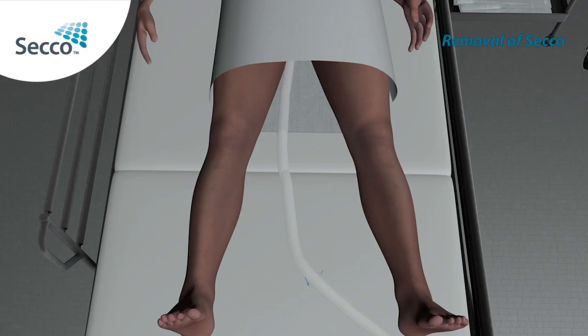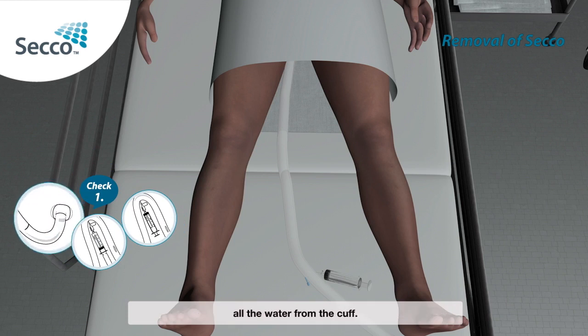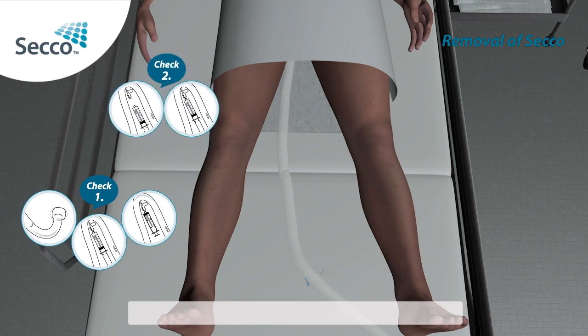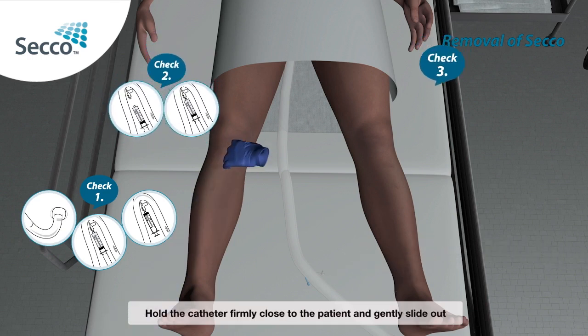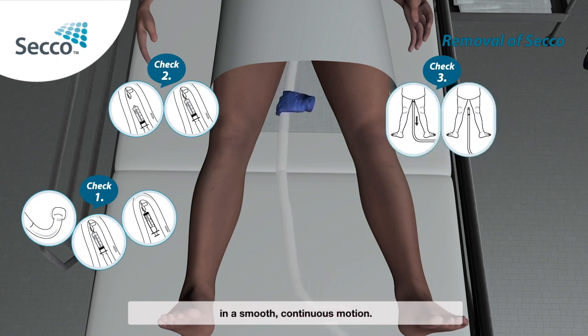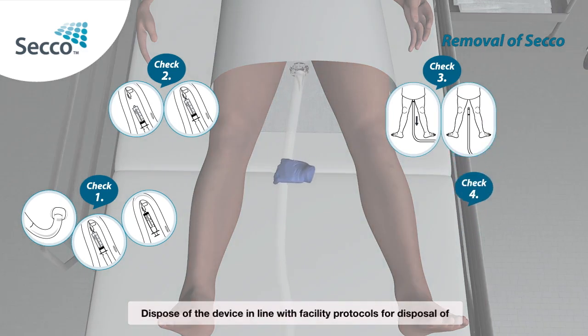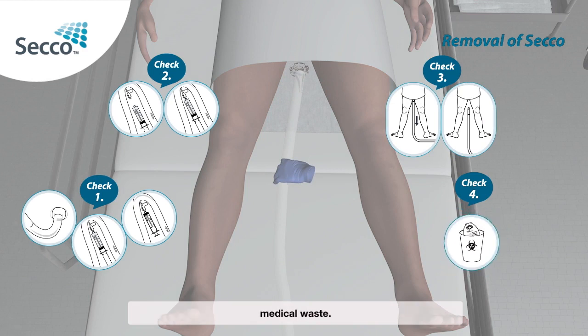Removal of Secco: Attach the syringe to the solid white inflation port and withdraw all the water from the cuff. Disconnect the syringe. Hold the catheter firmly close to the patient and gently slide out in a smooth, continuous motion. Dispose of the device in line with facility protocols for disposal of medical waste.